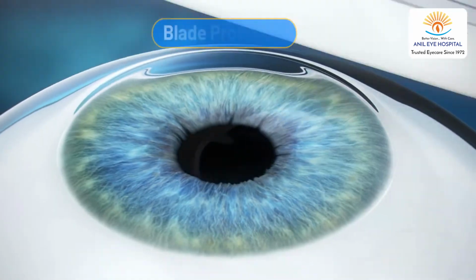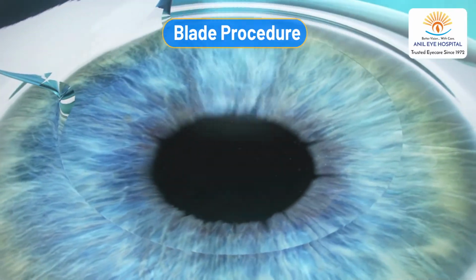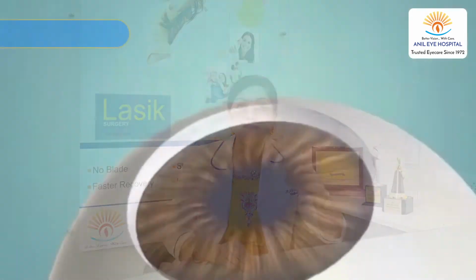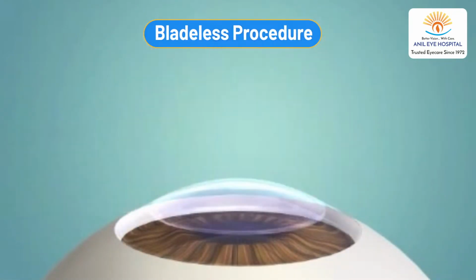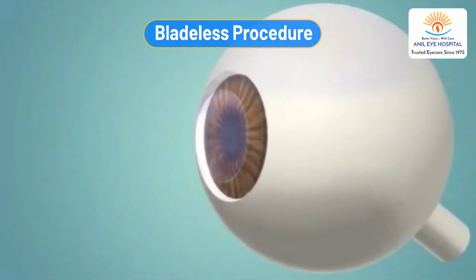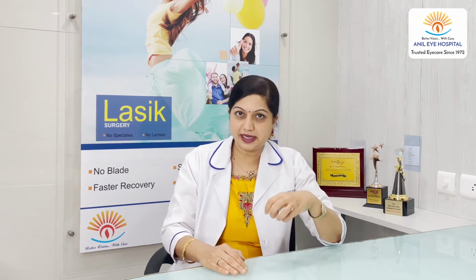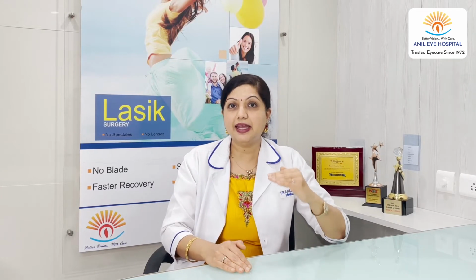Now in the blade procedure, a specialized calibrated microkeratome blade moves on the surface of the eye, creates a flap. Whereas in a bladeless procedure, we use a femtosecond laser, which is an extremely precise form of laser, to create a cleavage plane which makes the flap. Once the flap is made, in both the procedures, the flap is raised and the excimer laser for correction of the number is then applied. So the basic difference in the two procedures is in the making of the flap.